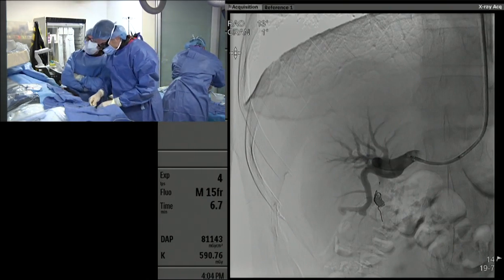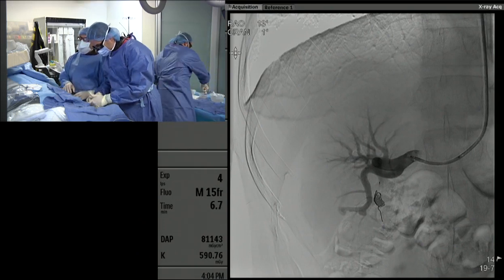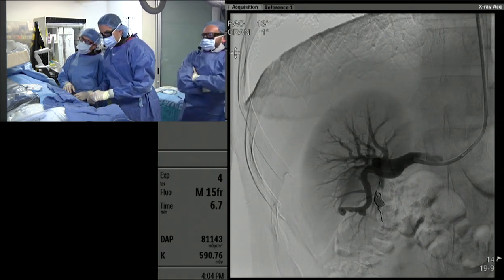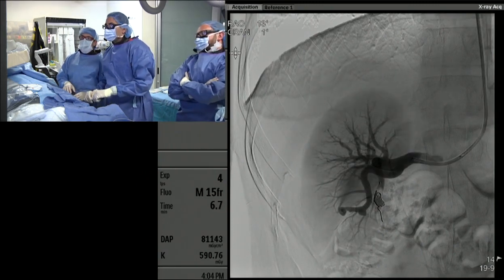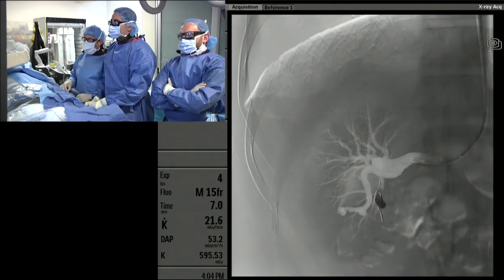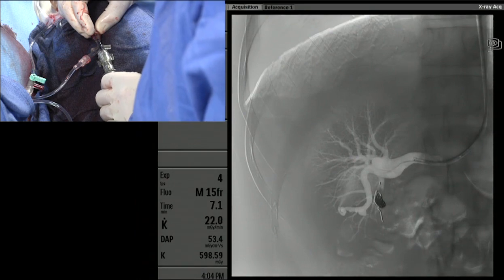What do you think? I think that run looks fantastic. When you go through that vessel that you've treated, I don't see any flow beyond that proximal, as it just shapes around that conical shape of the plug. I don't see anything beyond the coil pack. So it's a little weird angle here, but we'll get down there and then we'll get that plug in. This to me looks almost exactly like a pulmonary AVM.